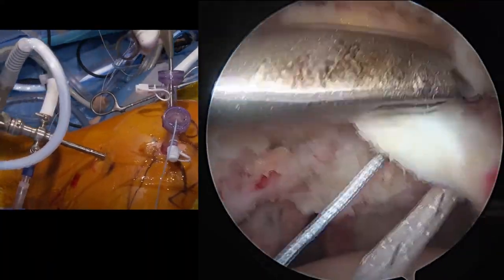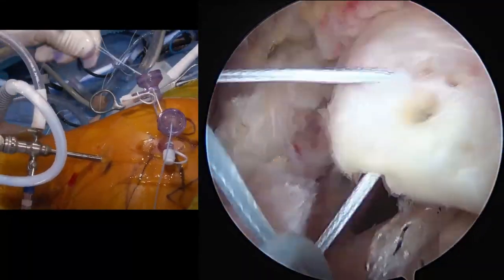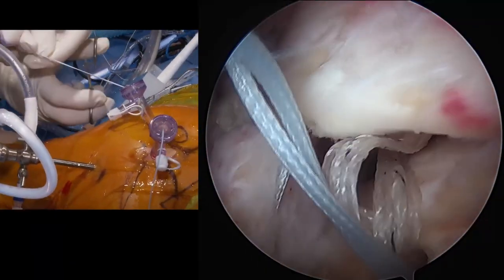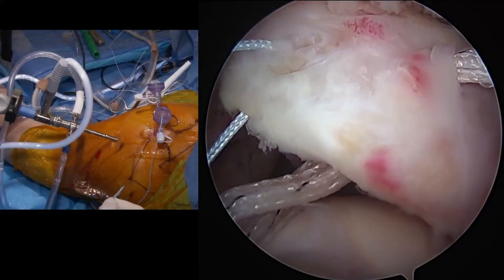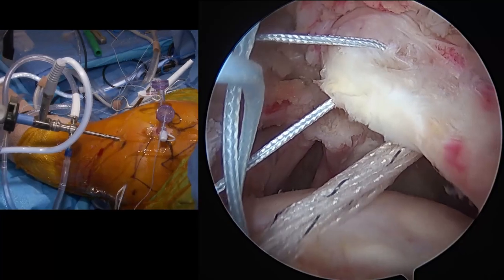Hemostat. Okay, put it on these two guys. So that gets us pretty close to being in a reduced position, which will help us out when we go to get our final repair. The white stitch is here, so we're good with that. And we've got that passed well.